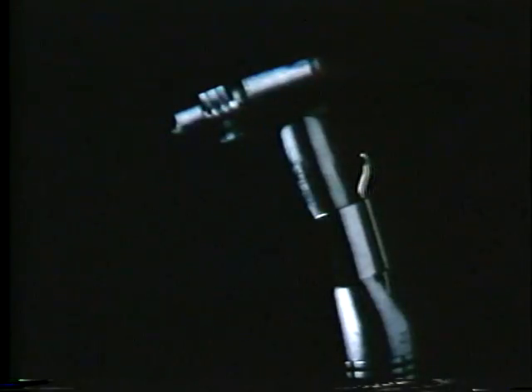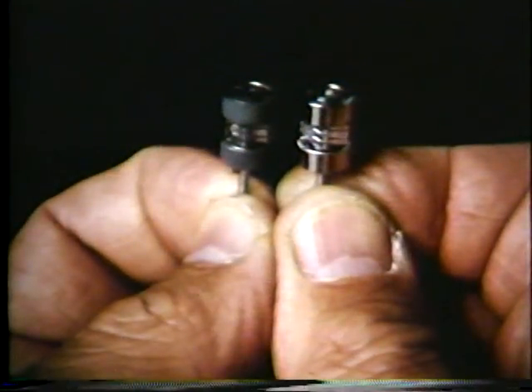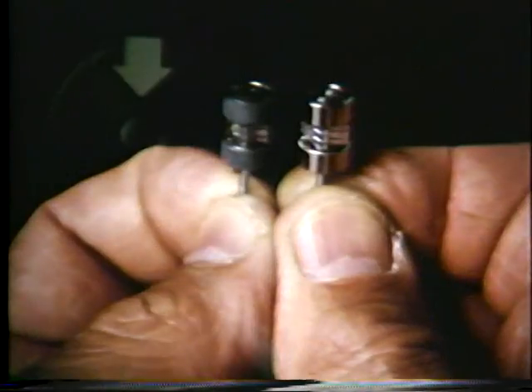Never remove both end caps at the same time, or you may damage the turbine inside. Clean the end caps with a small amount of WD-40 or alcohol and a lint-free cloth. Notice that in the small end cap there is a black washer that should never be removed. Using the WD-40 is essential because moisture from the drive air can stay in the handpiece and cause rust. Since the WD-40 is a drying agent, it can keep it from rusting.